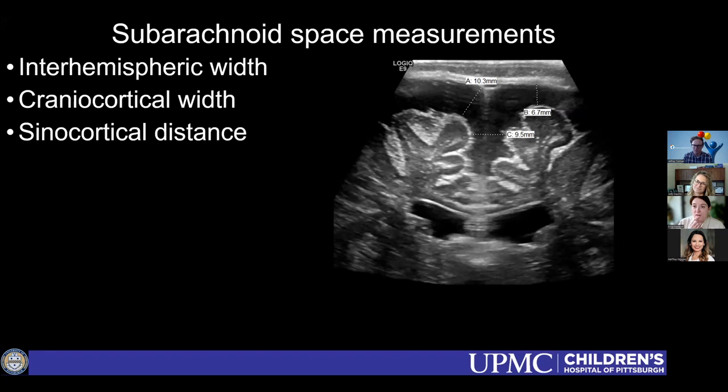The number of discussions that I have had with colleagues and sonographers within my group about which one of these 3 measurements is the best is more than I can count on my fingers and my toes. Everybody seemed to have a favorite. It was really challenging to figure out which one we were going to use, because there were solid camps of, no, I want it to be sinocortical, and no, I want it to be craniocortical, to the point where we were having full-on arguments.